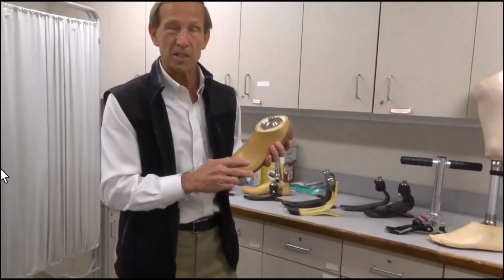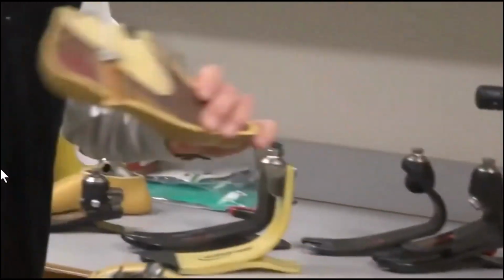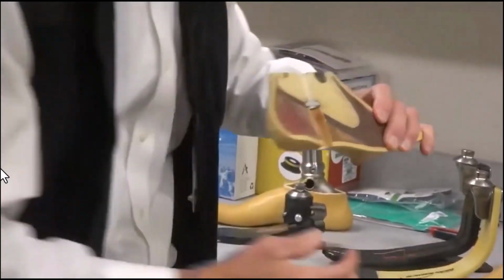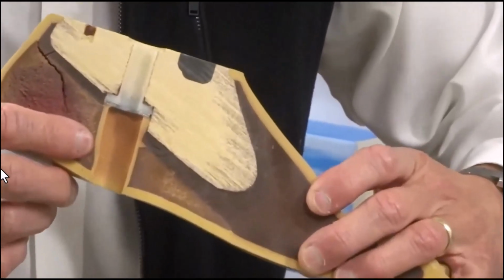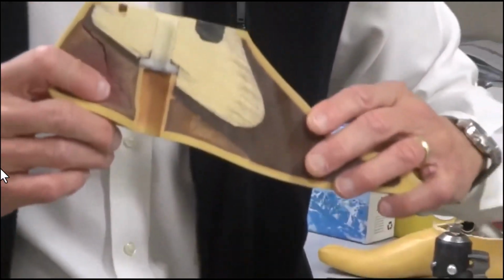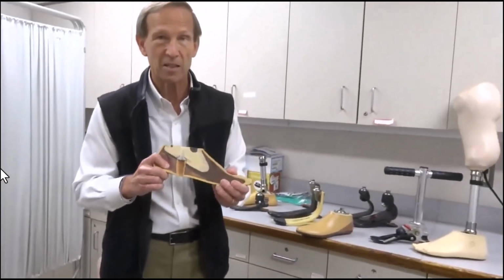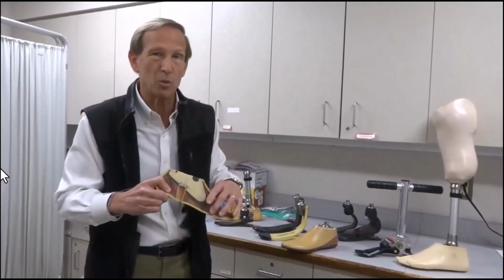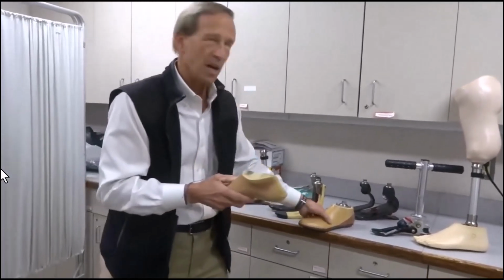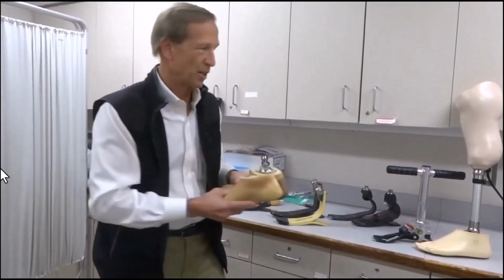Now you can't really see very much here, but if I show you a cutaway of this foot, you can see that it literally is a wooden block with a piece of foam. Now it doesn't mean it's a bad foot, but it's very light, it's very simple, and it's very low maintenance. The front half of the foot has a little bit of bend to it because it's rubber, but the rest of it is basically just one solid block. Now, I'm not a big fan of this, but if you want lightweight and simple, then it works very nicely.